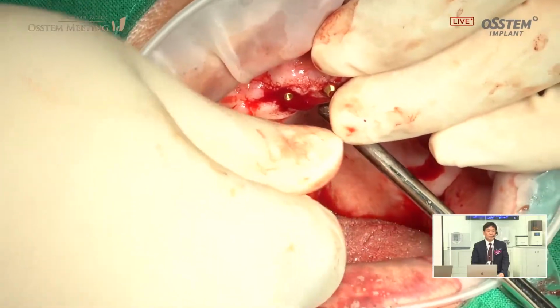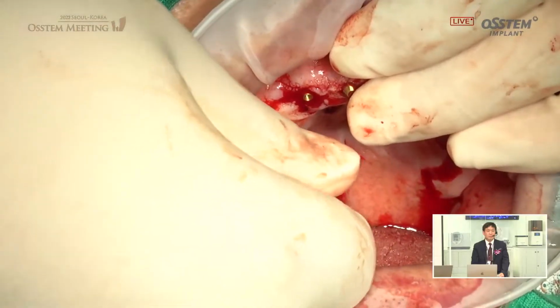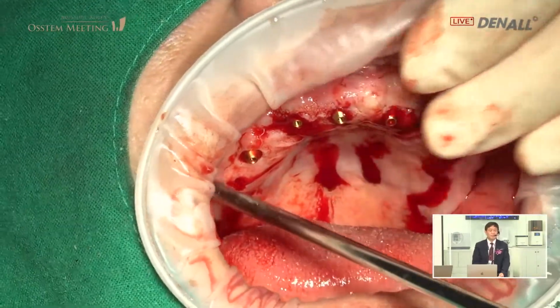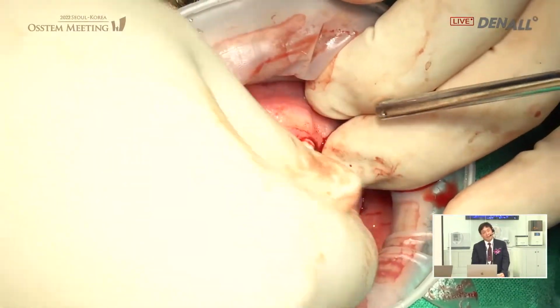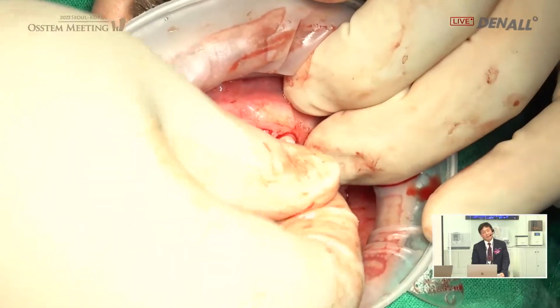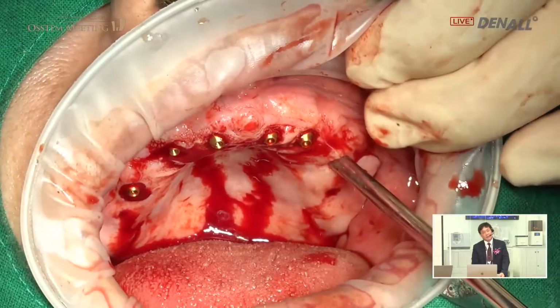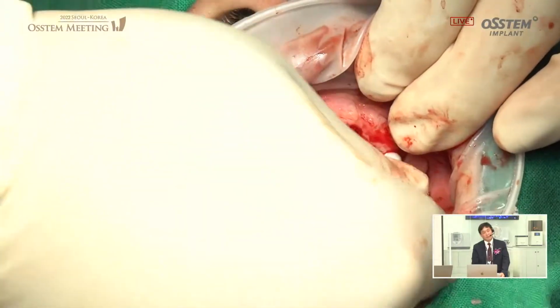That's what I prefer. In the handle stage, you need to tighten as much to be able to tighten easier using driver. If you do make it too loose, when you tighten using driver, at times it may not tighten as easily.